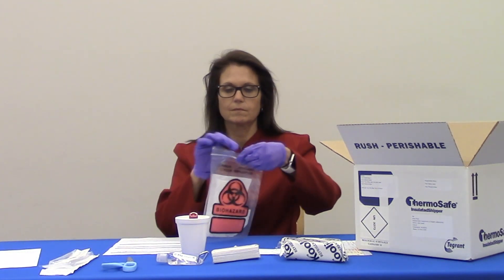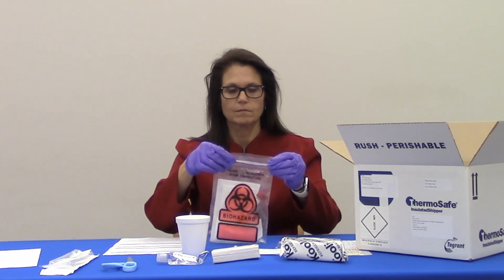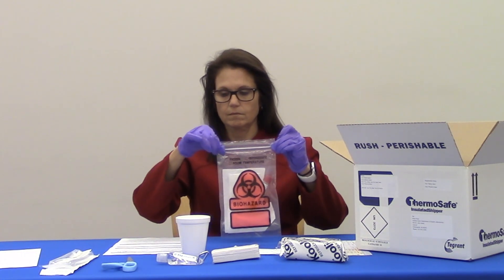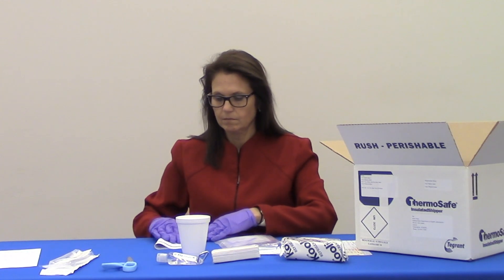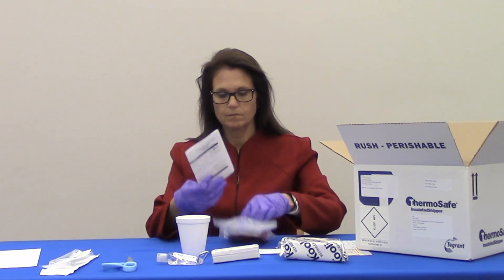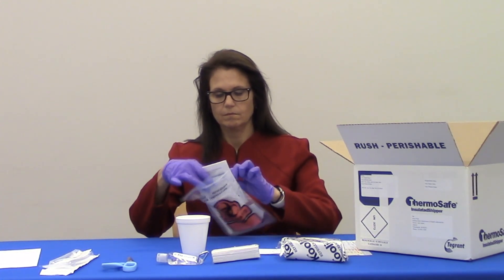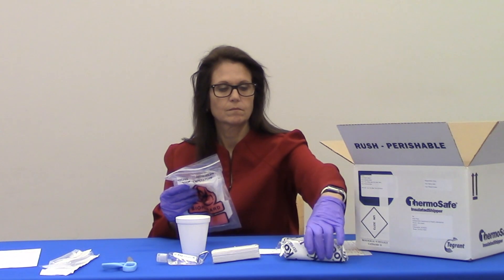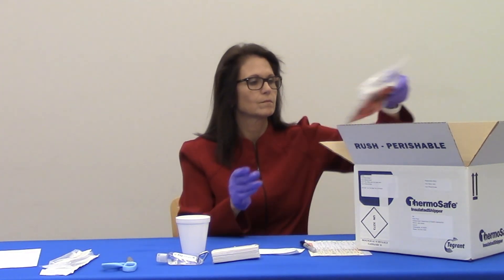Next, place the transport tube into the plastic biohazard bag, keeping the absorbent material inside the bag, and seal it closed. Put the completed paperwork into the outer pocket of the plastic biohazard bag. Remove the cold pack from your freezer and place it into the styrofoam shipping box, then place the specimen and paperwork into the shipping box. Place the lid on the styrofoam box and close it with shipping tape.